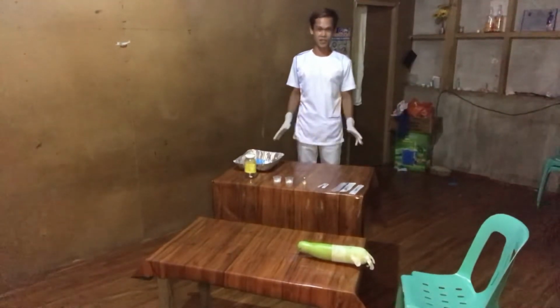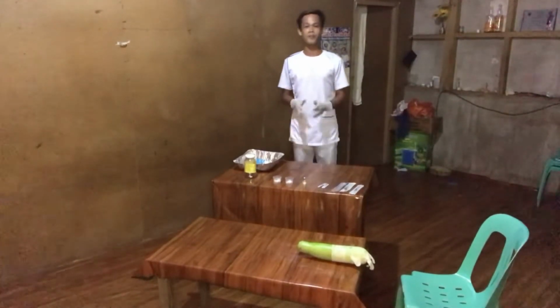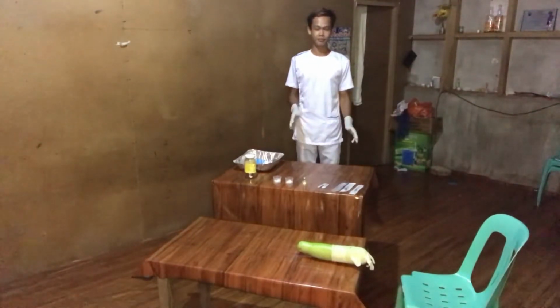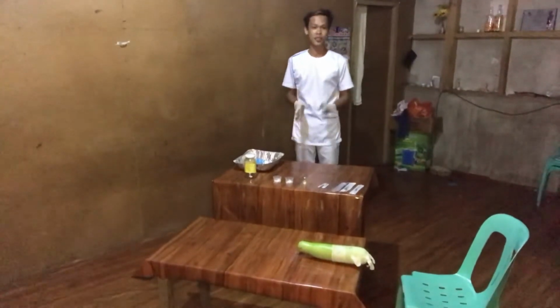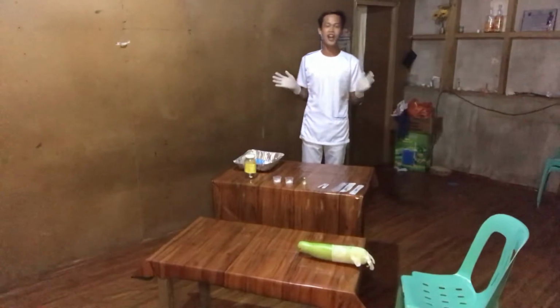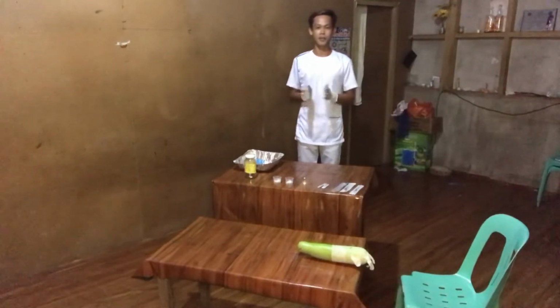So good day everyone, my name is Sanchez, BSN1A, and for today I'm going to demonstrate how to conduct parenteral administration. Under parenteral administration, we're going to perform intradermal injection as well as intramuscular injections. The first thing that we're going to demonstrate is the intradermal injection, which is a shallow or superficial injection of a substance into the dermis, located between the epidermis and the hypodermis.